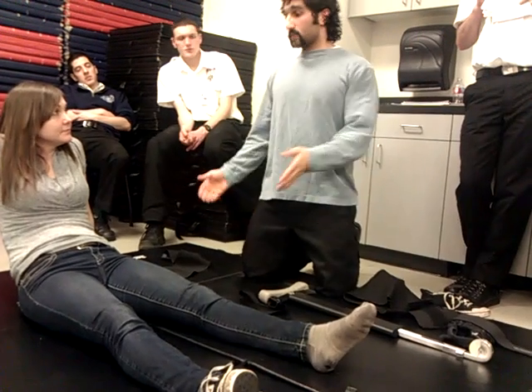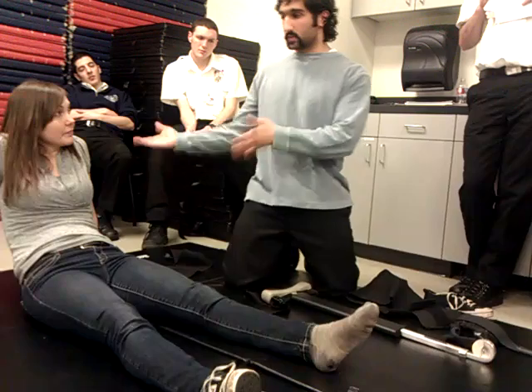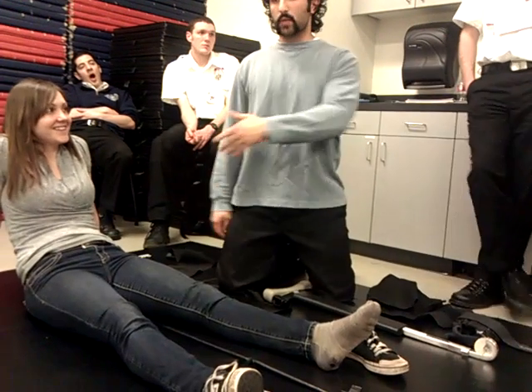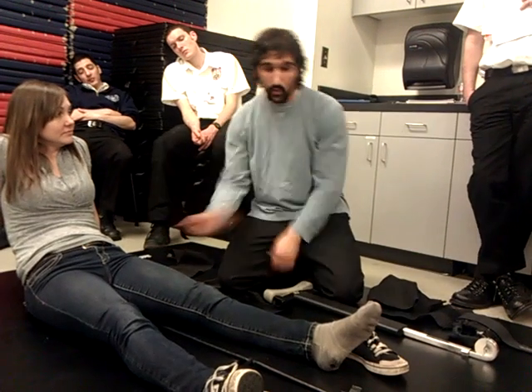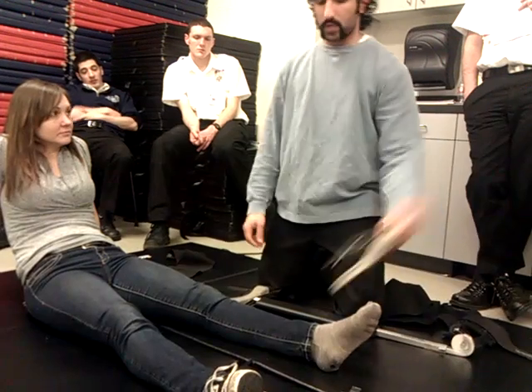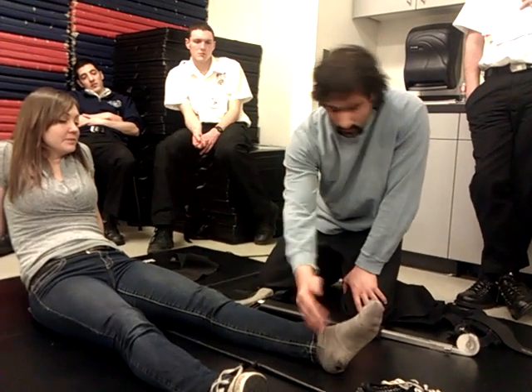Okay. Site of the injury for this, again, it's going to be mid-femur fracture, so I'm going to have, for the left leg, for this particular patient, she's wearing her shoe. I'm going to have my partner manually stabilize the site of the injury, cut and cover, and then you have them maintain that while you pull the pants, or that legging, off. You're going to remove the shoe and the sock, and check PMS. Pulse present. Can you go ahead and wiggle your toes for me? Which side of your foot am I touching?